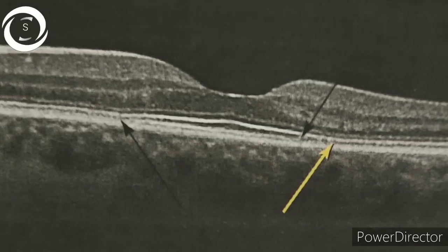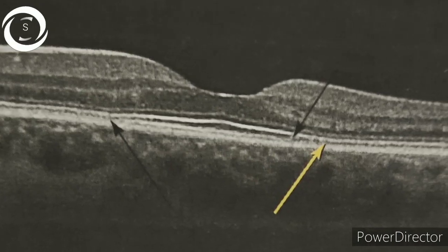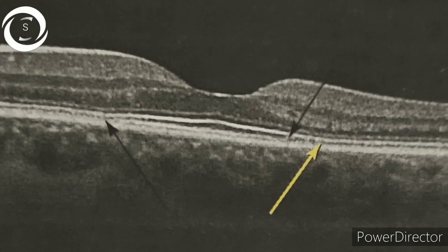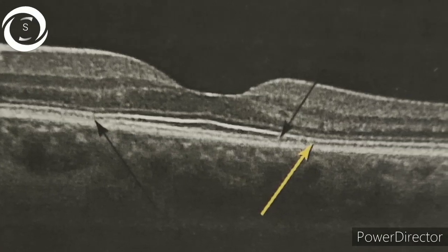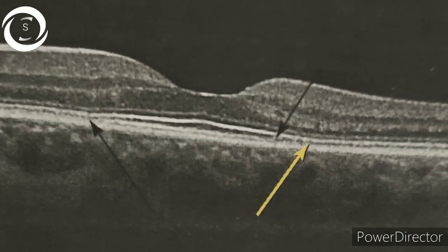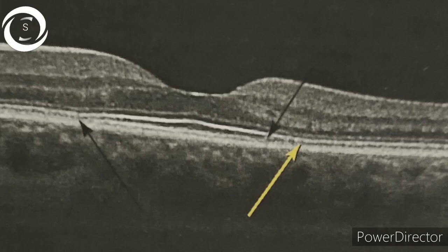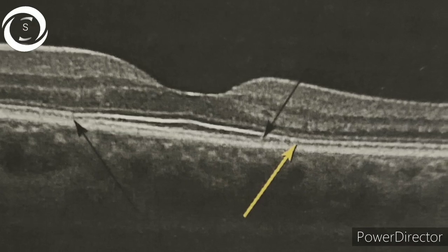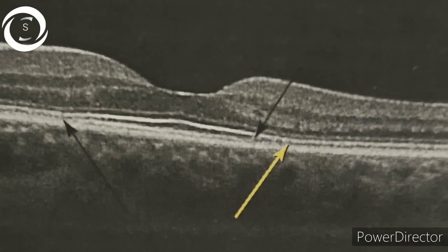In the eighth OCT, the scan appears normal, but if you look closely there is para-foveal outer retinal thinning and disruption of the ellipsoid zone. The signs are more evident temporally than nasally. This is hydroxychloroquine toxicity.